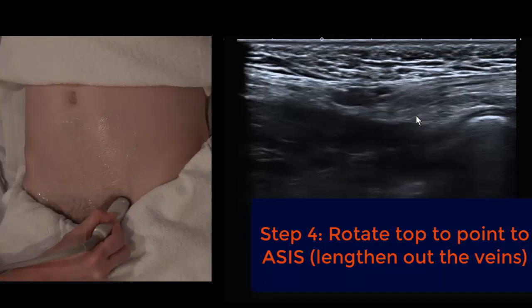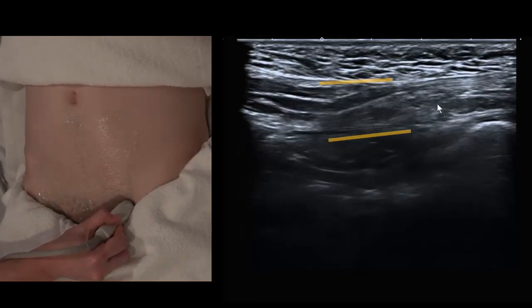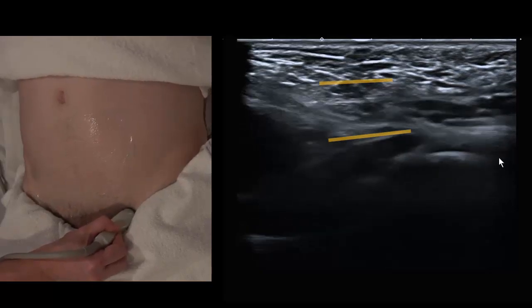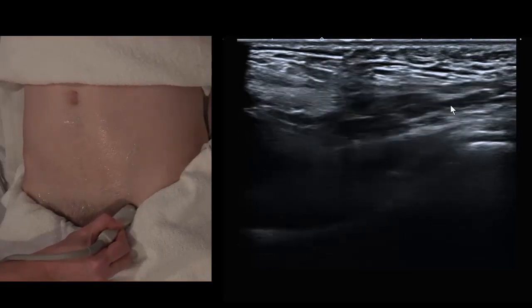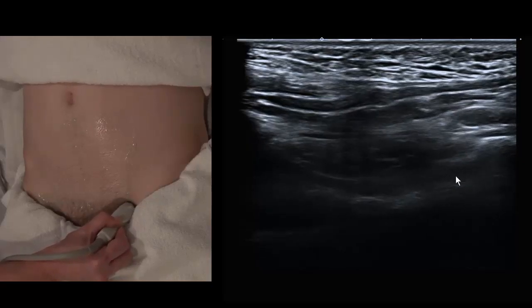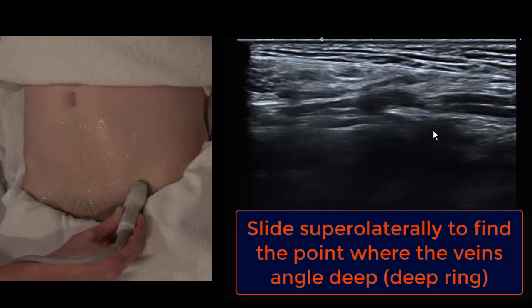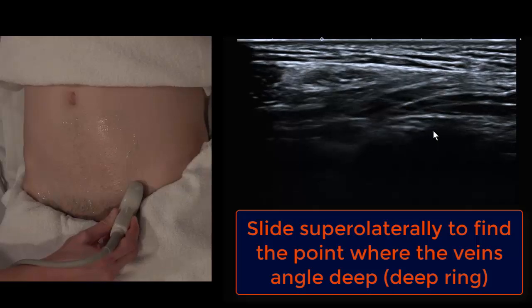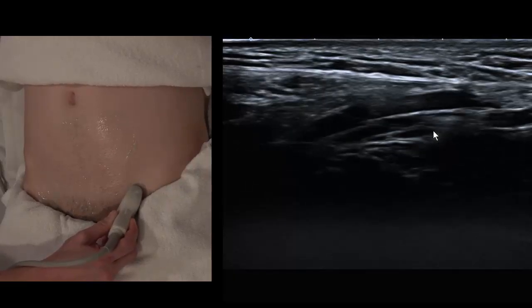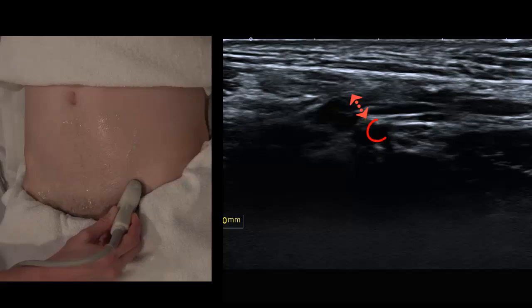Now rotate slightly obliquely to lengthen those veins out across the screen, identifying those two parallel white lines — the roof and the posterior wall. Ask the patient to strain: the veins within the spermatic cord will slide to the south and back up north when the patient relaxes. That's normal spermatic cord movement. Tracking the veins up to the deep ring, the veins just droop or drop into the abdomen. That's our deep ring, and at the deep ring we should be able to see the inferior epigastric artery at the back wall and a little triangular muscle over the top — that's the internal oblique.